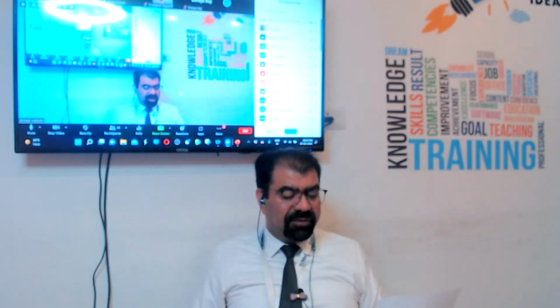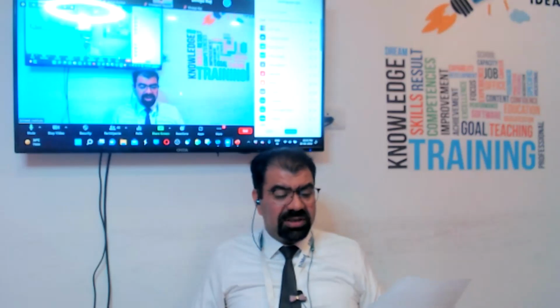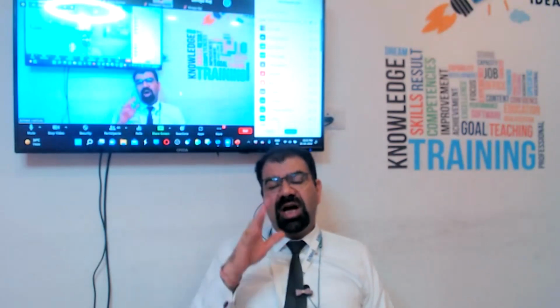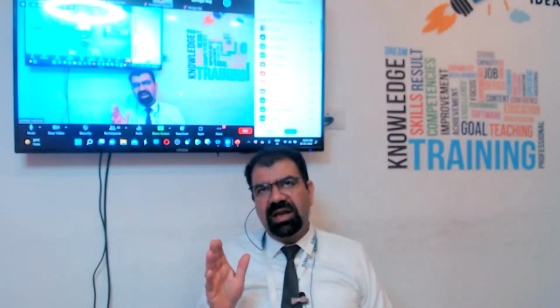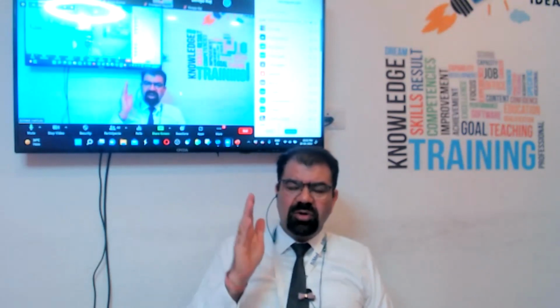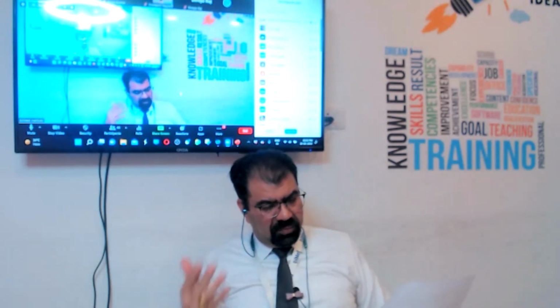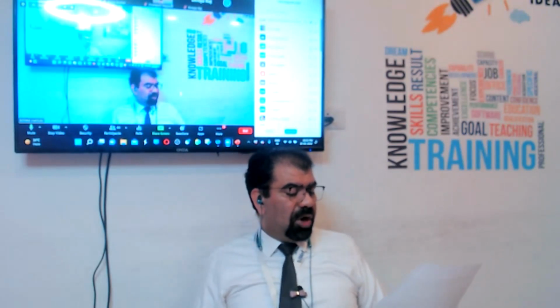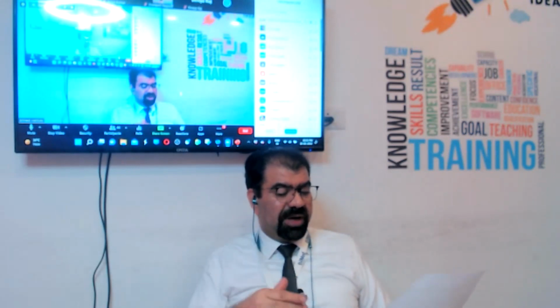So the second part of the question posted by Dr. Rishi is whether the NT scan is between 11 to 14 weeks. Yes, it is between 11 to 14 weeks, not after 14 weeks. Whenever you are taking an NT scan, take ductus venosus also. The third part of the question, also posted by Dr. Rishi, is that he is not making out the ductus venosus flow.